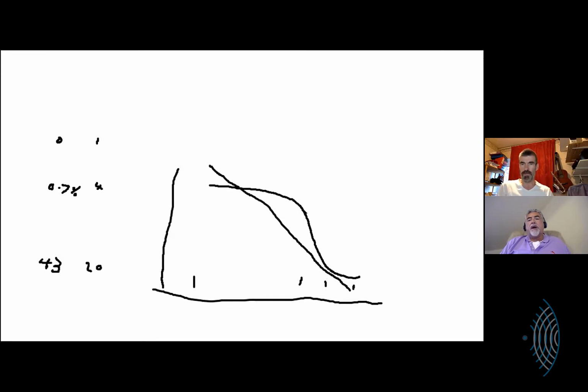I'm following you now. And hard things like metal, even if it would be at 70%, it doesn't really matter because it's going to be bright. Exactly. But the payback is that you can't really tell the difference between a little bit of calcium in soft tissue and a place where there is a good, very reflective boundary.